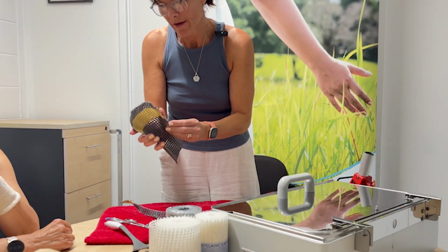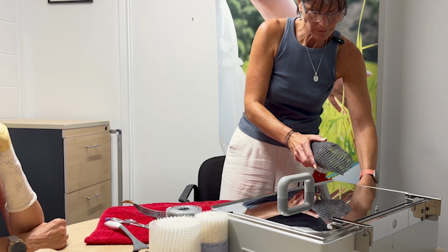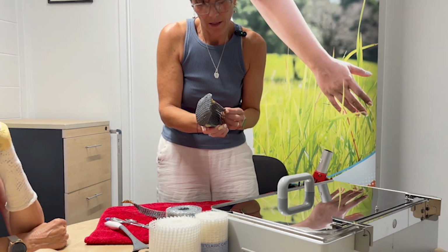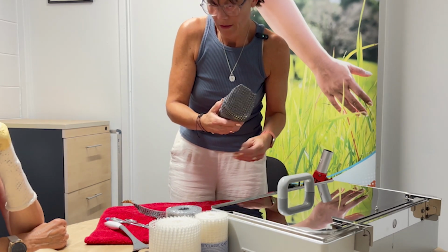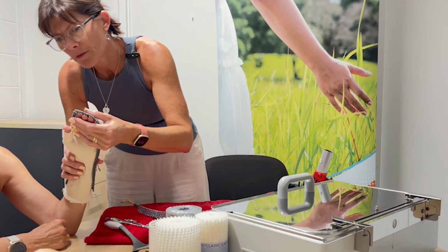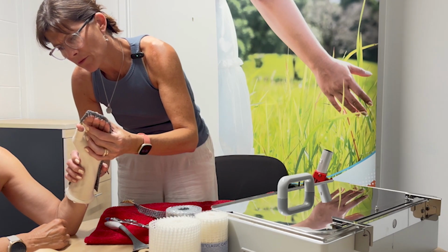Doing it that way, you should have no sharp edges, but you can just wave the edges over the heat gun and just soften them with your finger. And if there's any areas that you think might potentially rub, like around the thumb, you can put some edging tape on that area if you would like to.